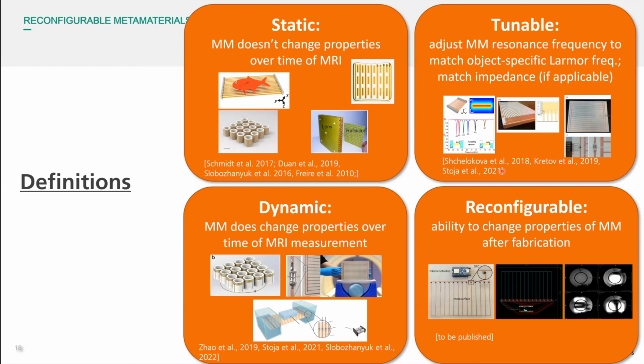So dynamic and reconfigurable mean something different, because a dynamic metamaterial can automatically behave differently for different scenarios, for example depending on the amplitude of the RF field, so that you can separate between the transmit and the receive field.